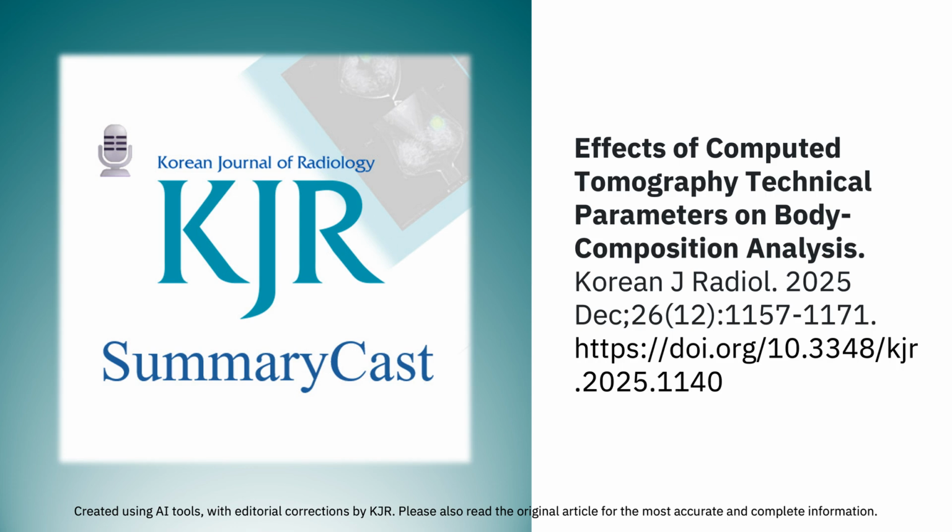as fat. Hold on. So with contrast, muscle looks bigger and denser, while visceral fat looks smaller but denser. That's a non-trivial set of changes. You can't just mix pre- and post-contrast scans in a data set and hope for the best. You absolutely can't. The paper says the values are not directly interchangeable, even though they're correlated. One study tried to apply a simple correction, subtracting 7.5 HU from post-contrast muscle, but the authors caution that such a simple fix isn't universally valid.